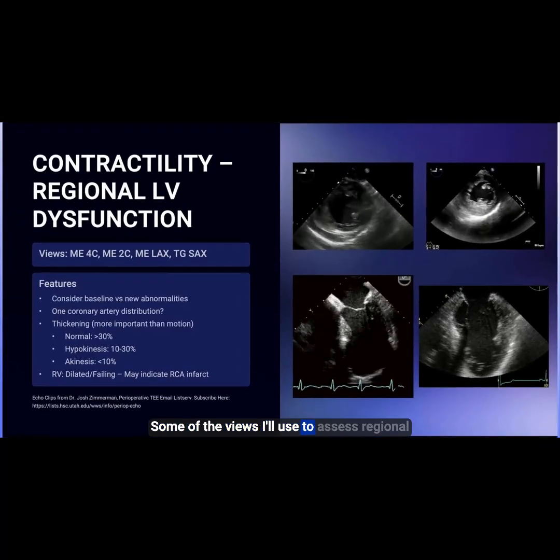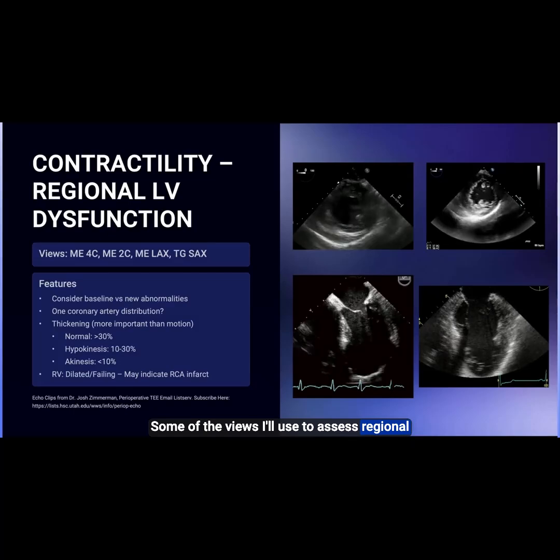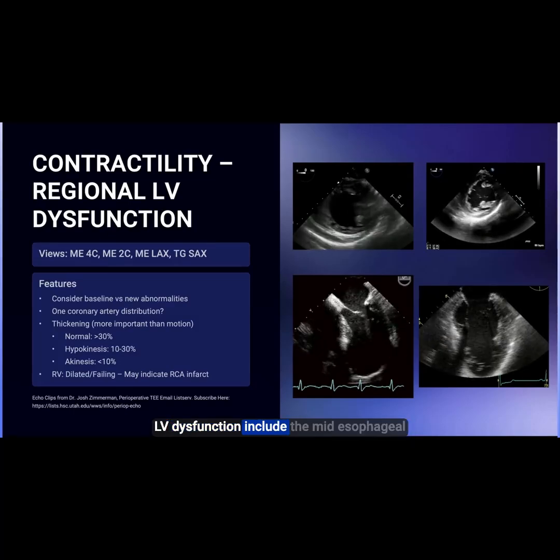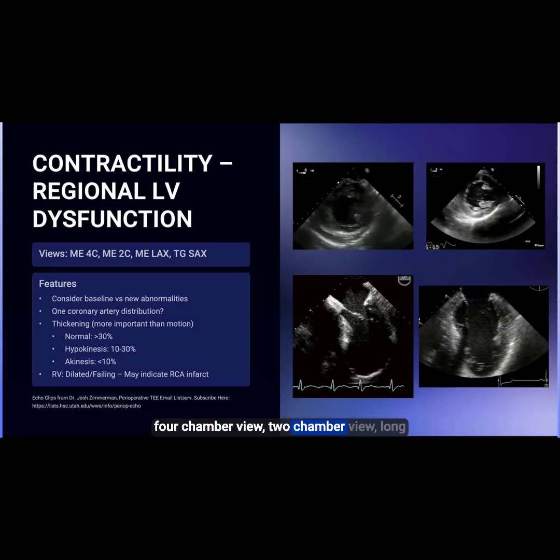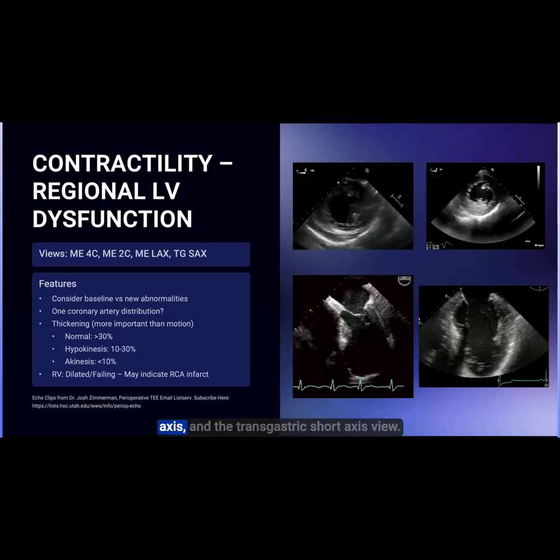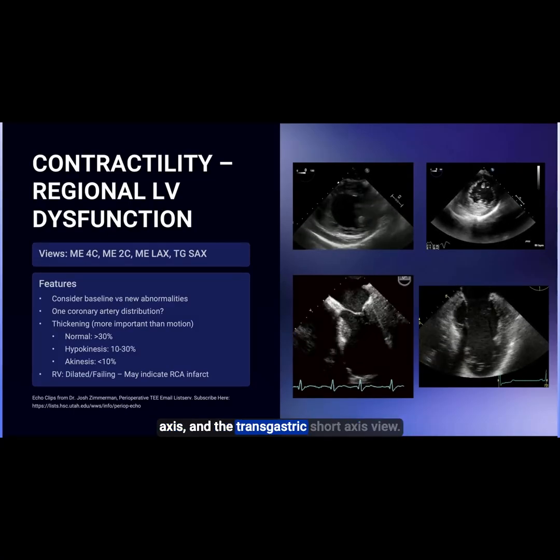Some of the views I'll use to assess regional LV dysfunction include the midesophageal four-chamber view, two-chamber view, long axis, and the transgastric short axis view.